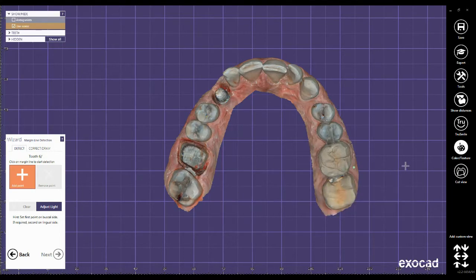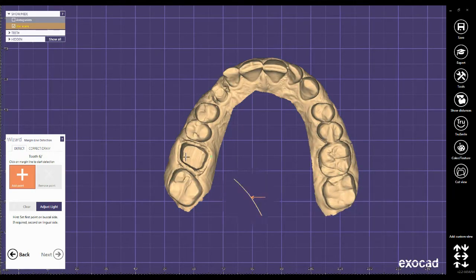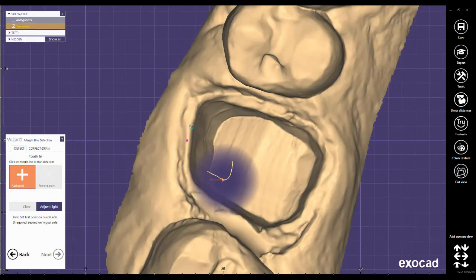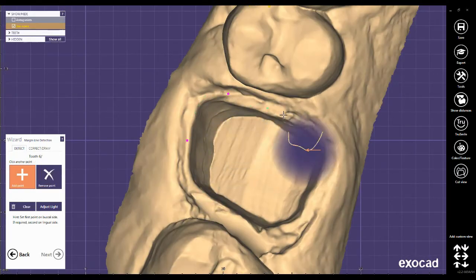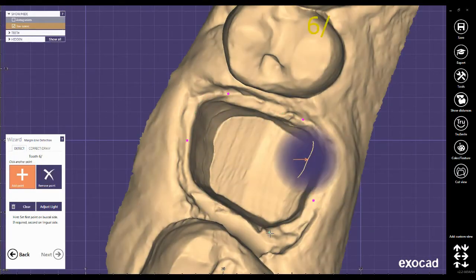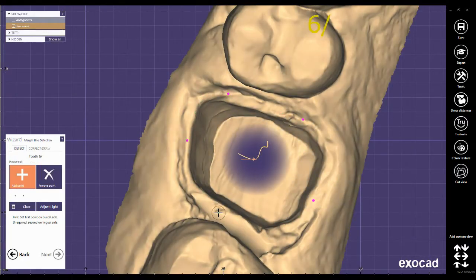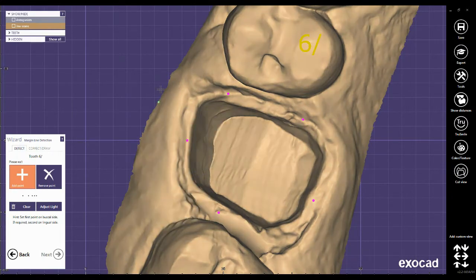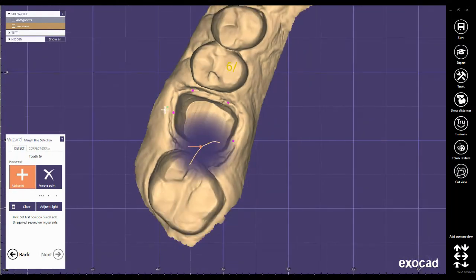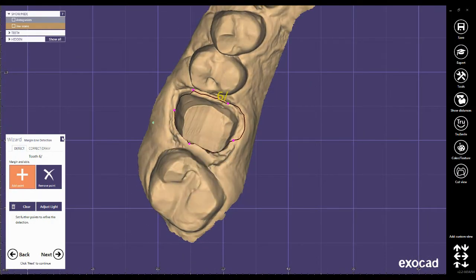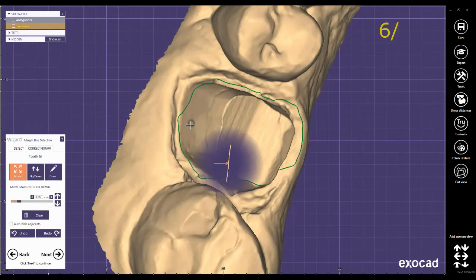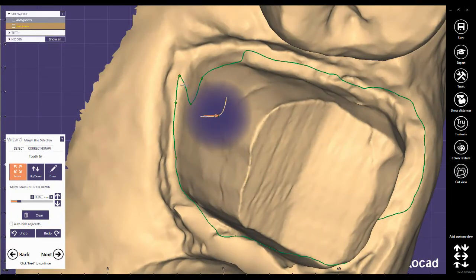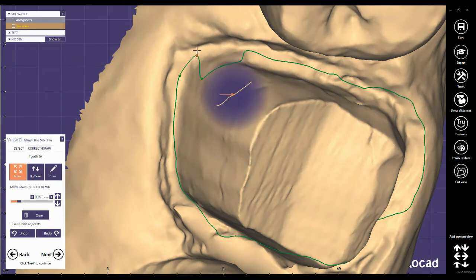Margin line detection. I think it's easier to click on color texture to have a better view. Click some points here for an automatic detection and then correct the margin line by left mouse click.